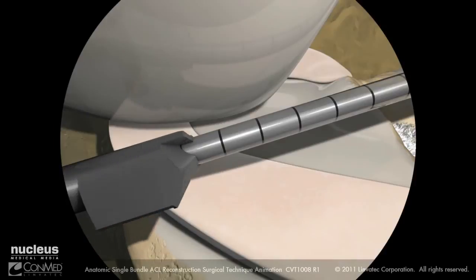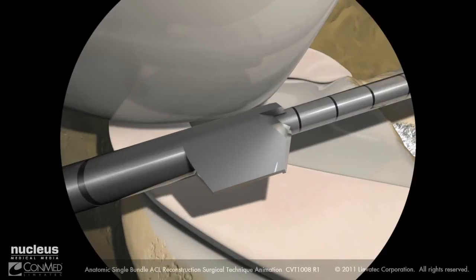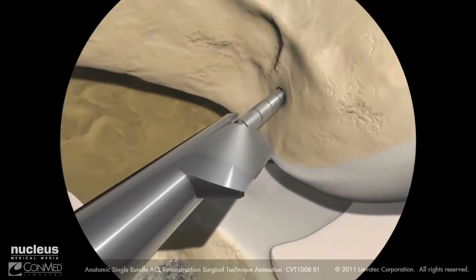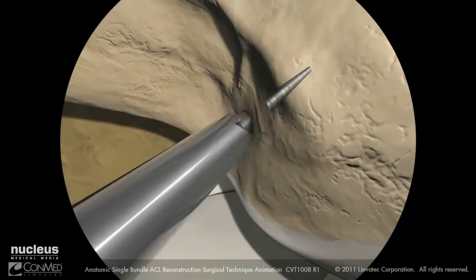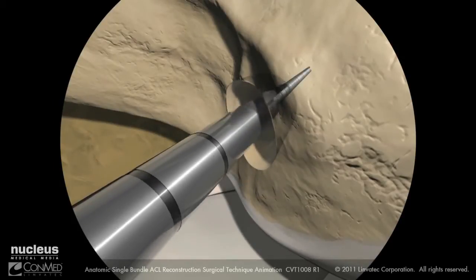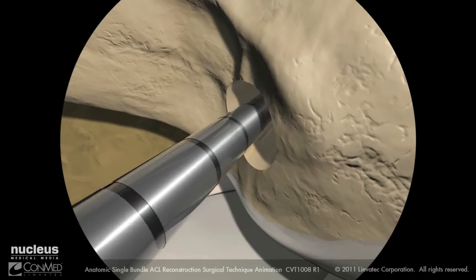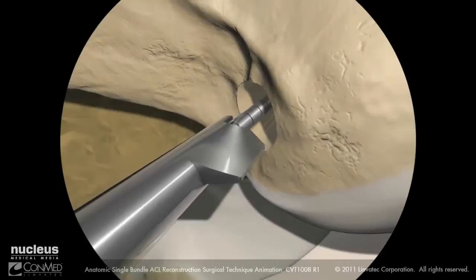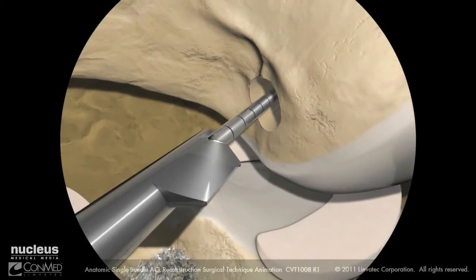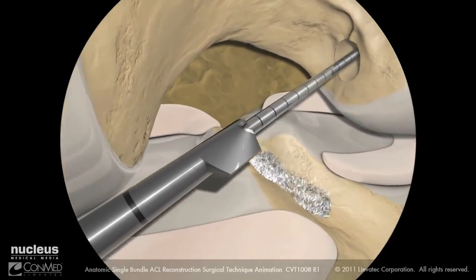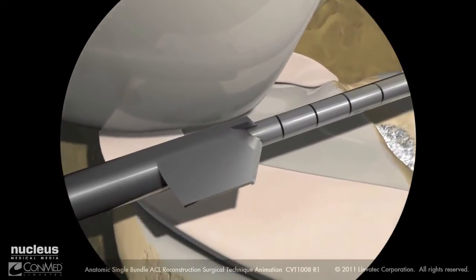Insert the monofluted sentinel drill bit over the guide pin through the accessory anteromedial portal with the cutting edge facing away from the femoral condyle, and advance the drill bit to the femoral ACL footprint. Using a piston-like back-and-forth motion, advance the sentinel drill bit to the desired depth cautiously to prevent blowout of the lateral femoral cortex. Pull the drill bit back slowly until the blade is visible in the joint space. Keeping the hand off the trigger, slide the sentinel drill bit past the medial femoral condyle and out of the portal, making sure to keep the blade oriented away from the condylar surface.